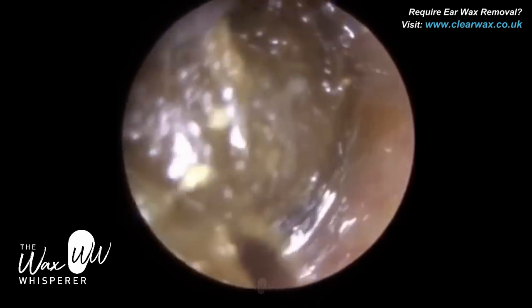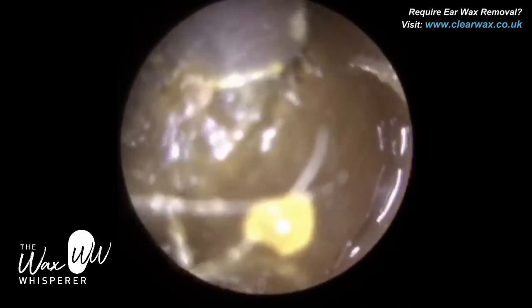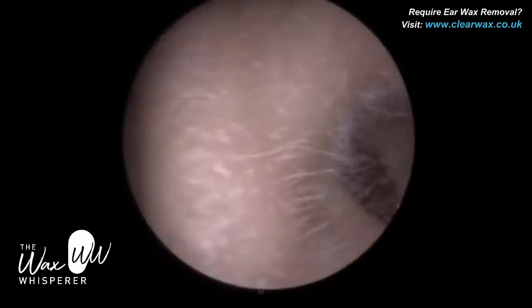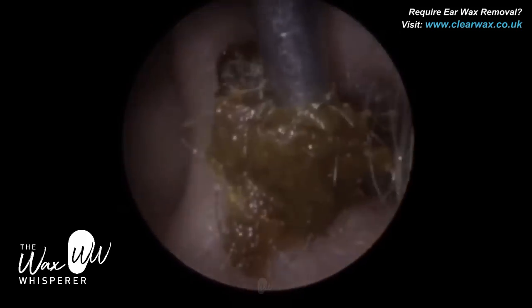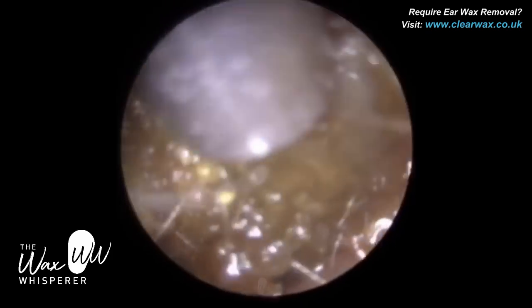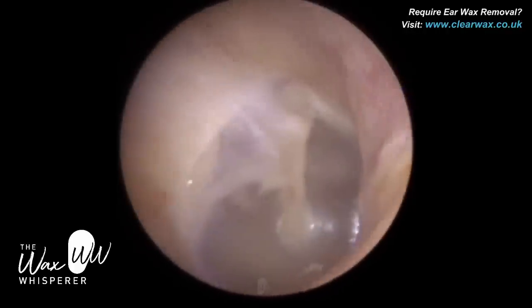Back in with the Zolnir suction probe, gently wriggling this plug of wax. It is quite medial and a lot larger than I thought it would be. Slowly gliding it forward — you can see the oil there. And there's another plug. As I've reached the entrance of the ear canal it's sliced in half — there's still a bit more. So it was a huge plug in the end. Sometimes you can be just amazed by how much wax you can remove. You think you've removed it, you go back in and it's all there.